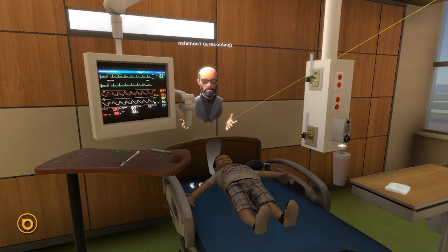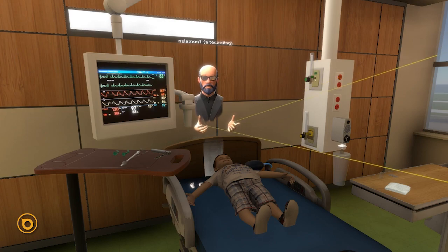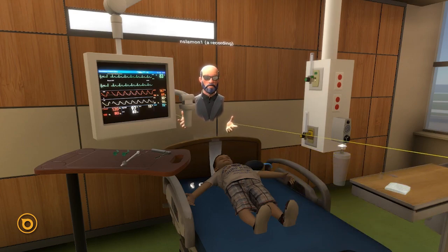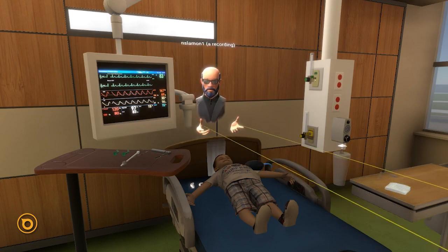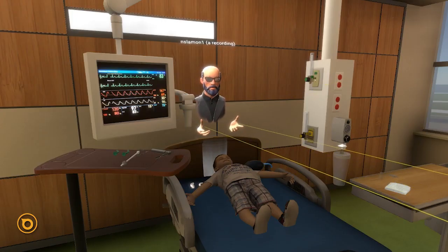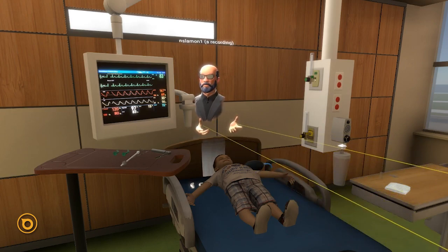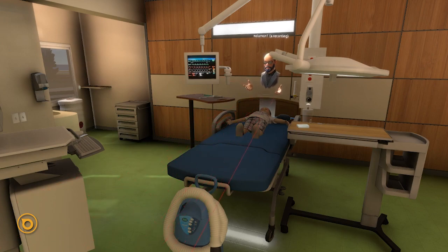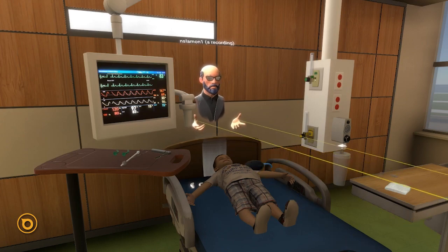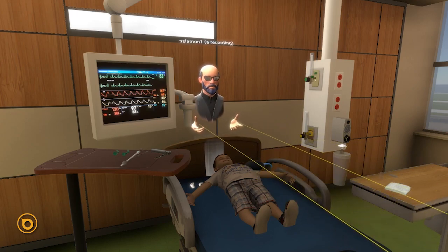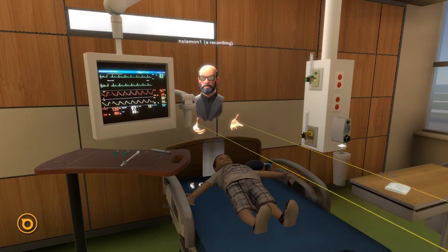For monitoring, we'd like to have all vital signs displayed continuously: heart rate, respiratory rate — which in a patient with respiratory failure may be very fast or very slow — and pulse oximetry, which when intubating may be low. We also want continuous end-tidal CO2 once the breathing tube is inserted. A great trick: turn on the audio display mode for pulse oximetry. As the pulse ox falls, the tone of the beeping decrements, so you know you need to get the airway in faster.